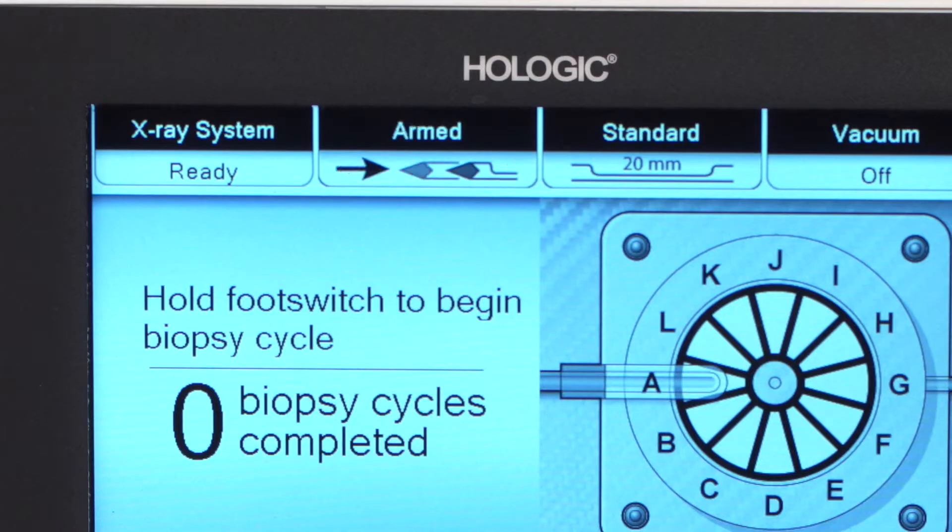While in biopsy mode, the technologist or physician will arm the device from the remote control. The system will not arm under standby.